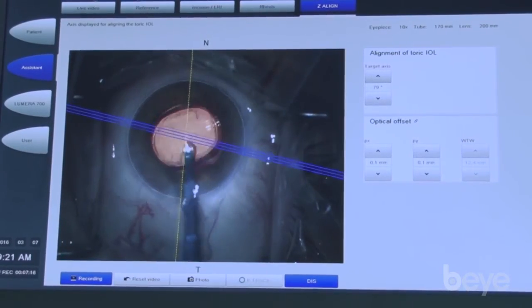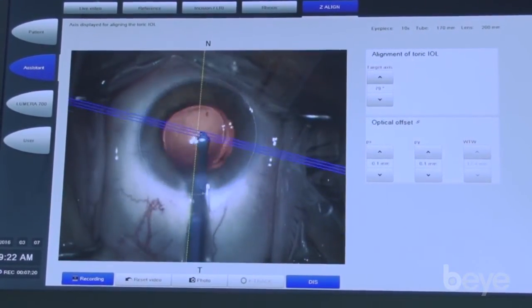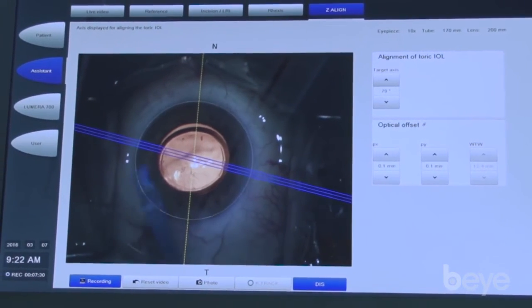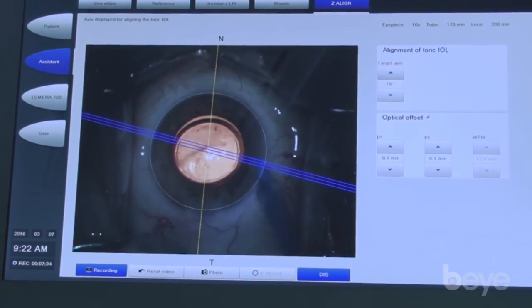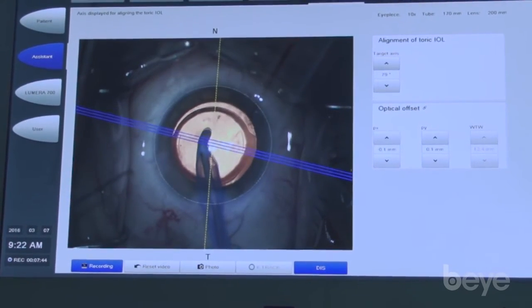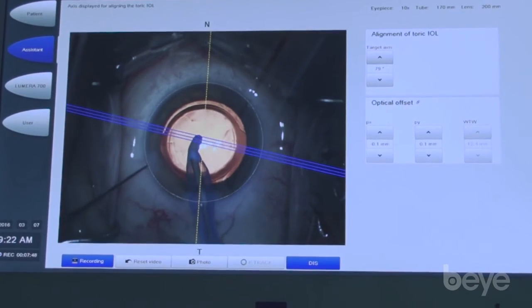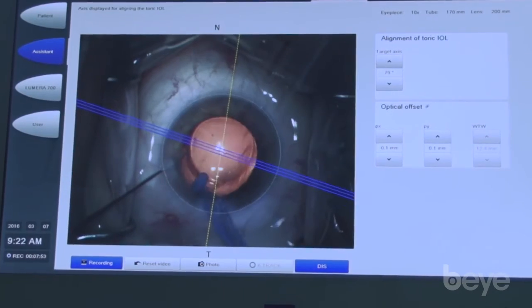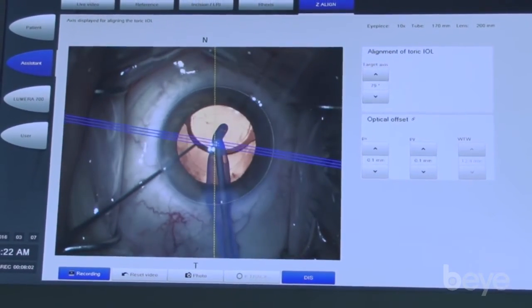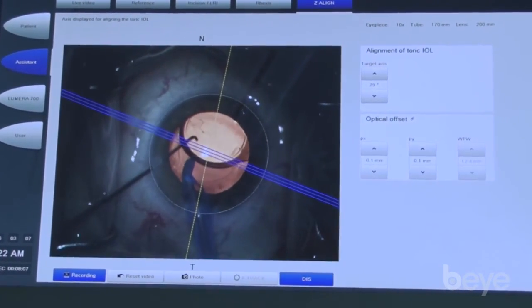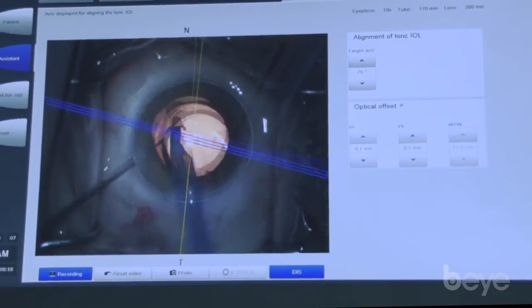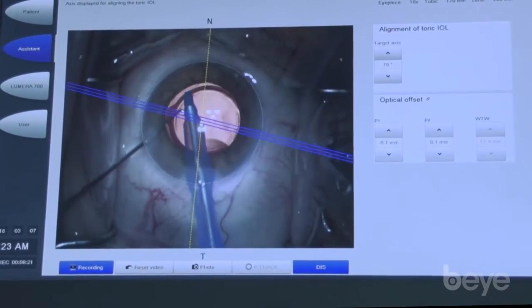The only other thing I'd emphasize is the importance of lining the marks on a toric lens in parallel. Don't try and get it within the hash bars — take a Sinski hook and try to line them up on one of the lines here, not within the three lines but actually on one of them. This can be done with the soft tip of the I/A or with a second instrument — I usually have my Sinski hook in my other hand, and it can be done bimanually as well. Make sure you remove all of the OVD. The beauty of the Stellaris is that it does it so gently and is so forgiving — it really is an extension of the phaco machine and the Callisto. The integration is phenomenal.